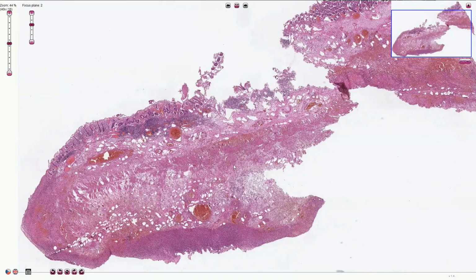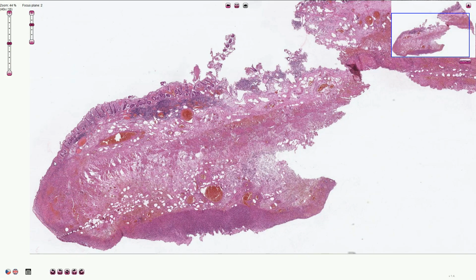This is the picture of the hemorrhagic necrosis of the intestine, also called hemorrhagic infarction. Here we have the partially preserved mucosa, and this is the affected necrotic part. Intestinal necrosis is always hemorrhagic because we have a lot of blood vessels in the small intestine and colon.